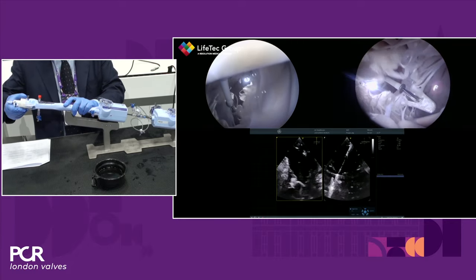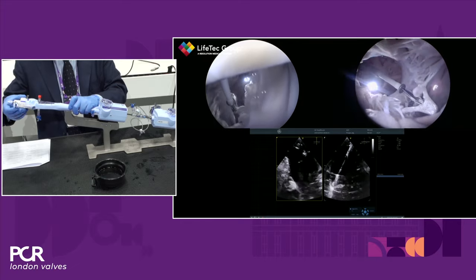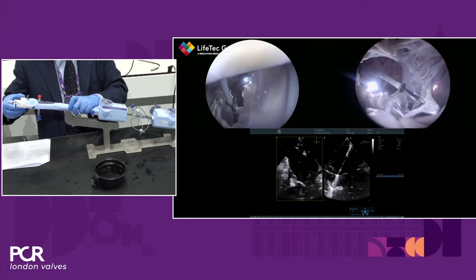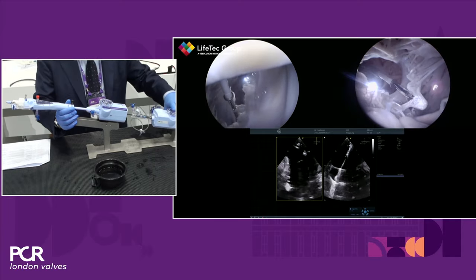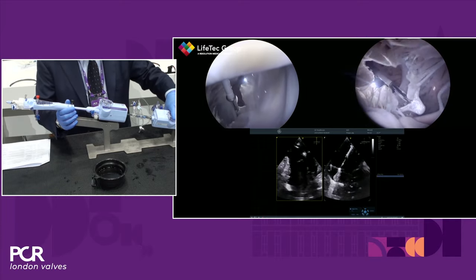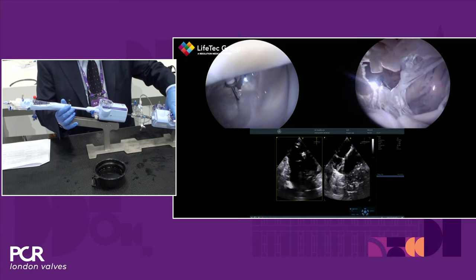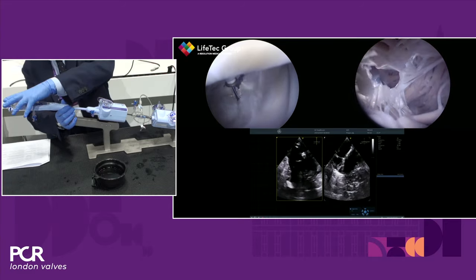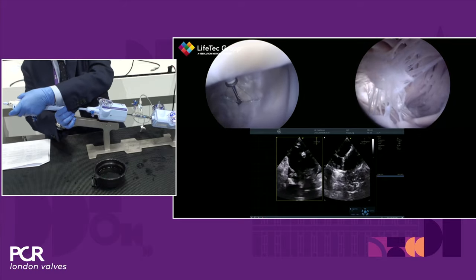So now the clip is below the leaflet. Paolo crossed the valve with the clip closed, which is a safety precaution in order to avoid getting entangled. And now he's opening the clip again below and trying to get as much leaflet as possible in the clip arm. And now the grippers are dropped down.